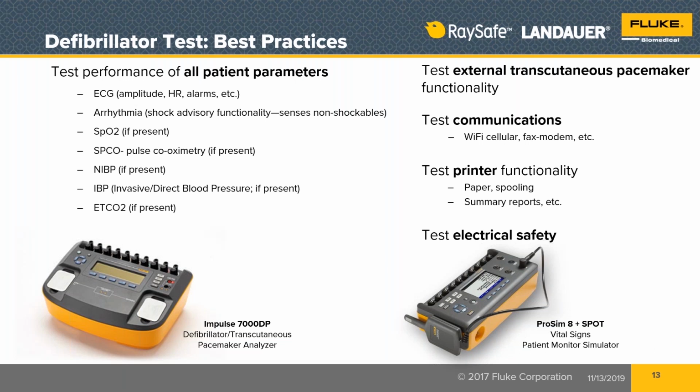For other defibrillator analyzers, you may need a stopwatch in order to run that test. And the test is from the moment you push the charge button on the defibrillator until the ready tone sounds, how long did that take? There's a specification in the standard and in the manufacturer's service manual procedure that tells you what that pass-fail criteria is. And so you need to make the measurement, and that charge time test is part of what we do.